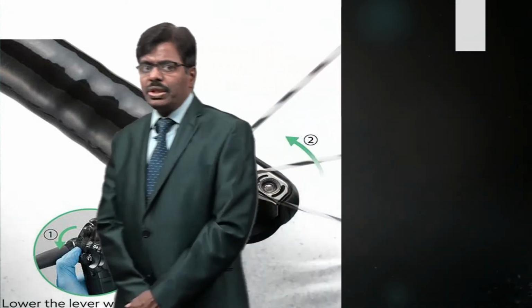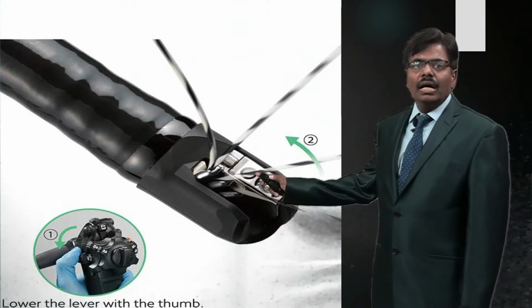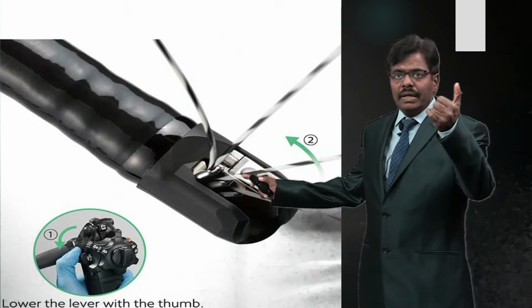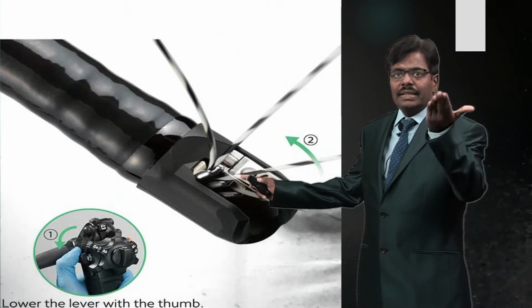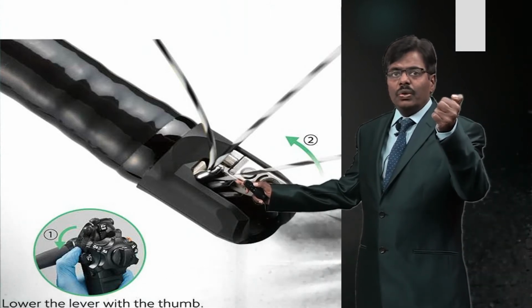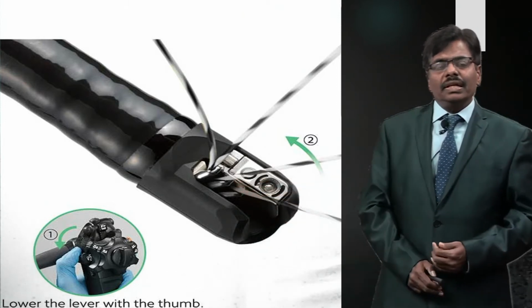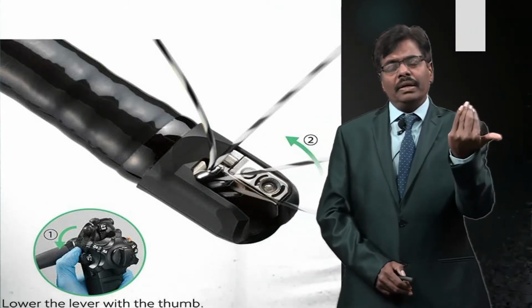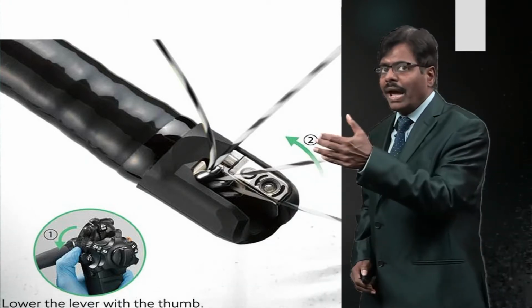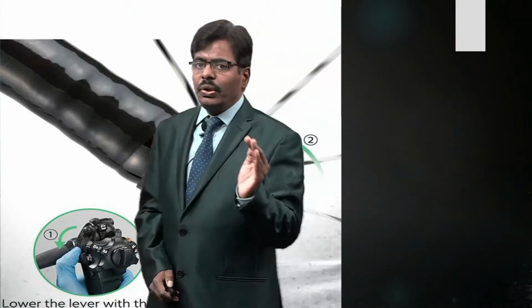And this is a little picture to show you how an elevator is going to help you. As soon as I put my hand in the insert, you can see, and bring the thing down like this, then it takes it up like this. So you put your finger down on the elevator in the control head, and the elevator lifts and drives these accessories into the pancreatic duct or biliary tract, depending upon the amount of down you are making and also the angle at which you are going. So the elevator is so essential. I think that is going to make a difference.